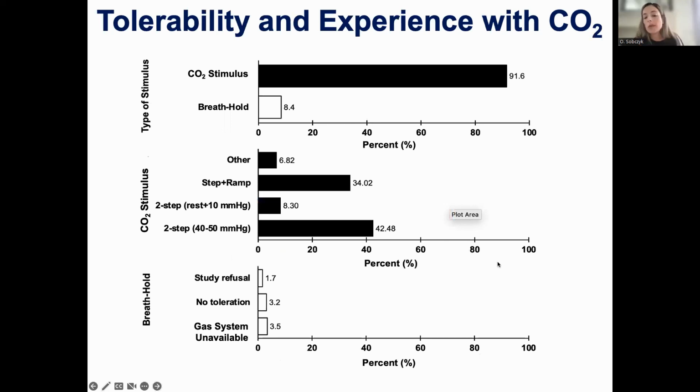So I mentioned we've been studying CVR in our lab for 20 years. I just wanted to summarize our tolerability and experience with CO2 because we get this question a lot. We've done over 1,400 CVRs, and that breaks down to approximately over 200 normal scans and over 1,200 patient scans. The patient scans mostly include large vessel disease, such as carotid artery stenosis and moyamoya.